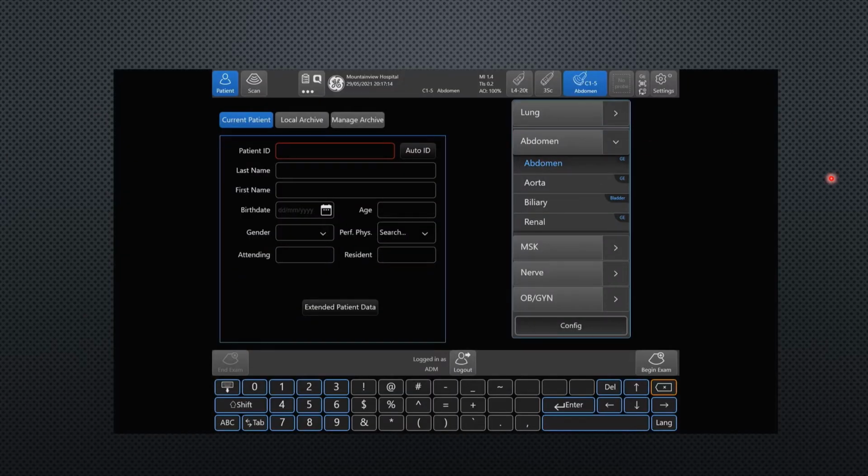So this is your patient interface, and you always want to scan the patient's wristband first whenever possible. A lot of times it'll actually erase your 3-4, which goes in this field right here, this resident field. Yep, this is your resident field. So that's where you want to put your 3-4. The software at Mountain View is such that you can actually scan the back of your badge where it has your 3-4, but Sunrise will not currently allow you to do that, though that may be a change we can expect in the future, that you'll be able to scan your badge at Sunrise as well.